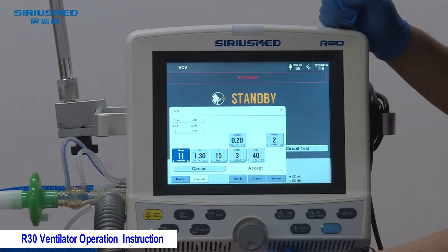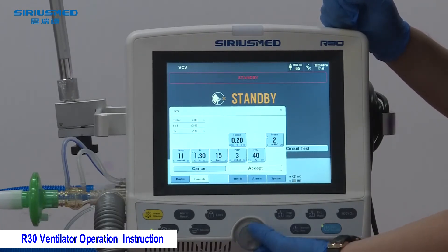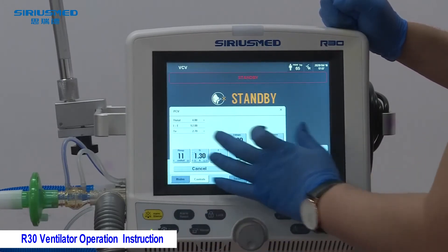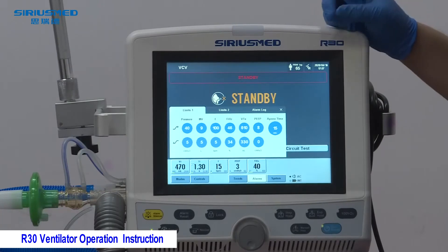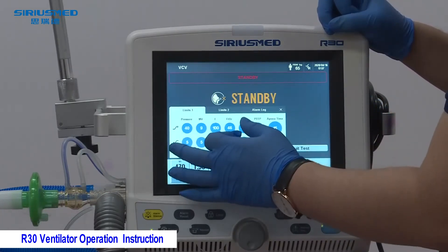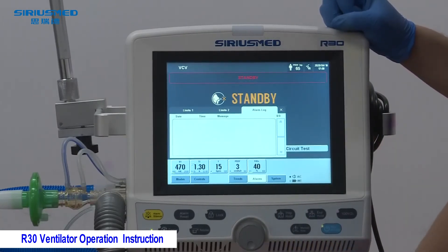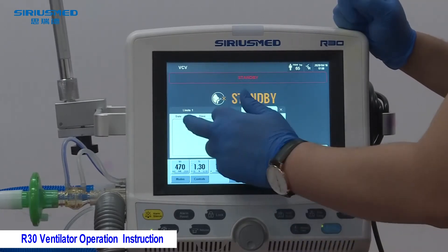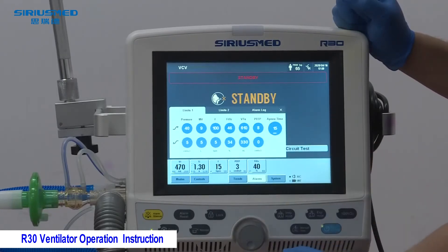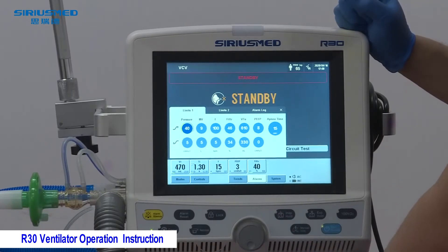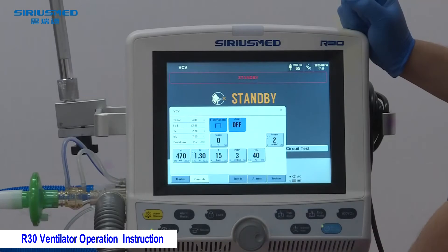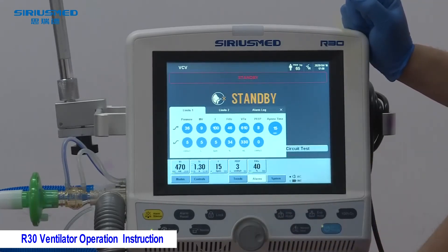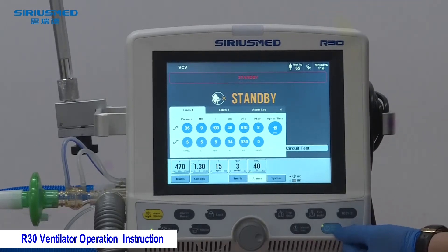To adjust parameters, first select the parameter you want to change, then use the knob to adjust and click the knob to confirm. After adjusting all setting parameters, go to the alarm section. There are maximum and minimum alarm settings which the doctor must set according to the patient's condition. There is also an alarm log that records up to 100 alarm events. After setting alarms, press Start to begin ventilation.